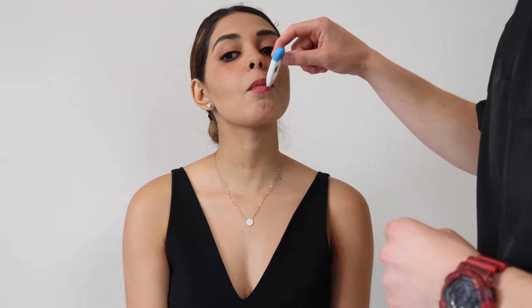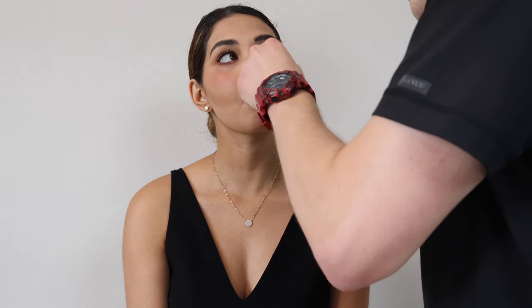Lastly, we're going to get a temperature — oral route this time. You want to place the thermometer right underneath the patient's tongue and have them close their mouth. We'll let that sit there until it reads. The temperature is 98.2.